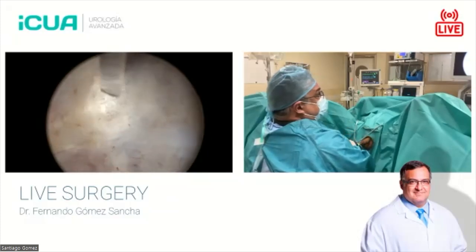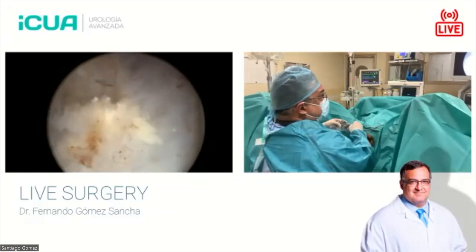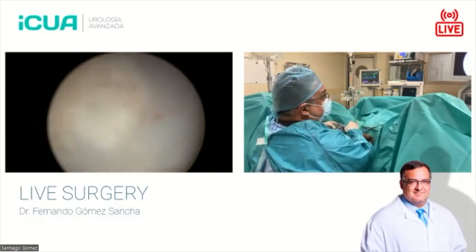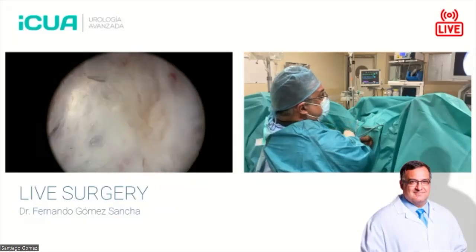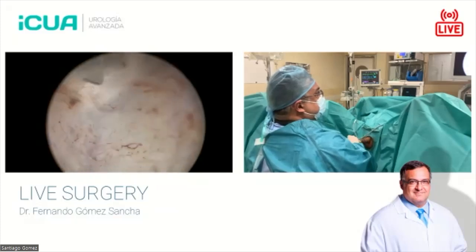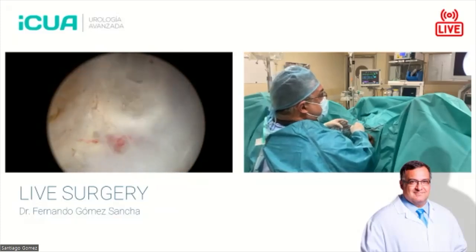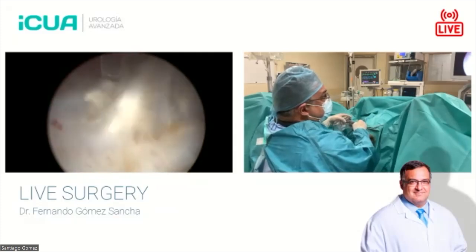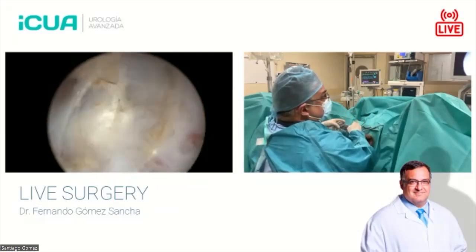Also, the capsule is quite fibrous. It's quite, how do you say that? Uniform. So we should see a relatively uniform plane, not bumpy, not with a bread-like appearance, which is typical of BPH.